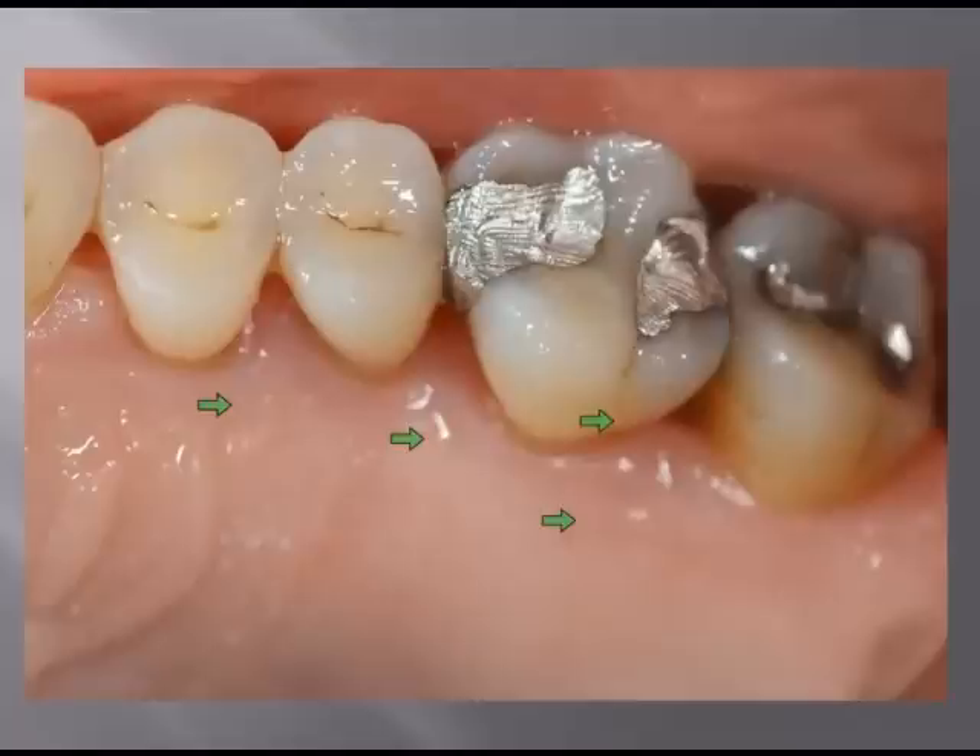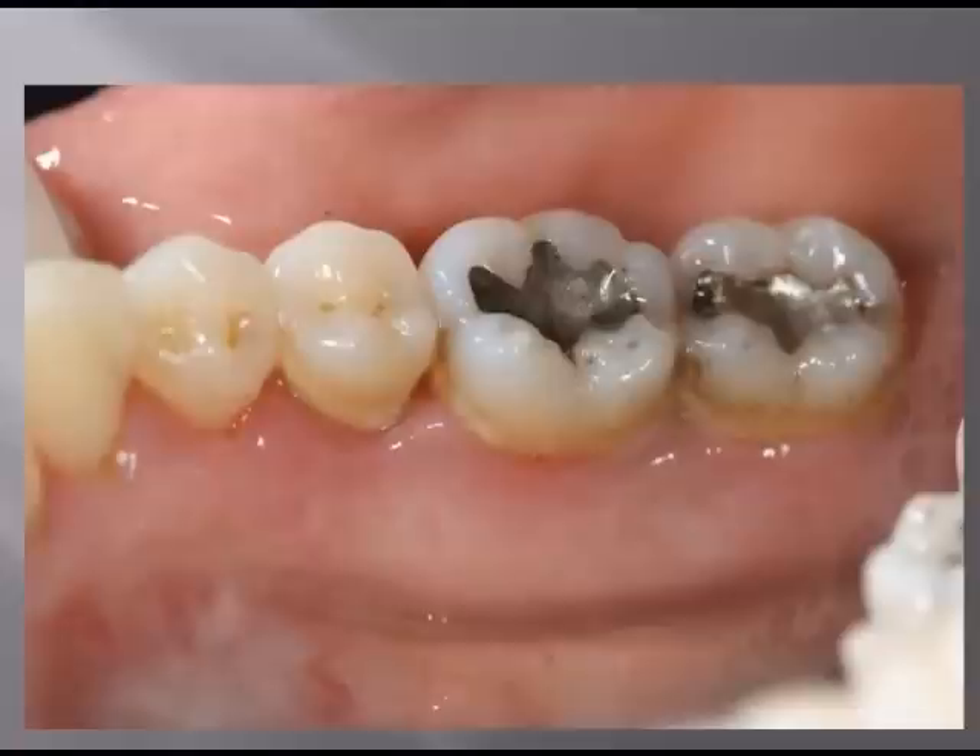We have nice, healthy tissue here. We haven't really lost any significant amount of attached tissue on the palatal side. You can imagine if we did traditional gum surgery how much we would have had to remove to get the pockets down. With LANAP, we don't have to remove the gum tissue and expose more root surface, which increases patient sensitivity and chance of caries.